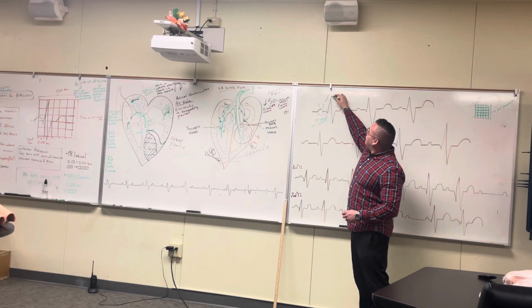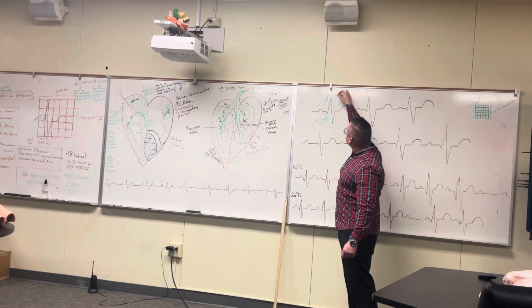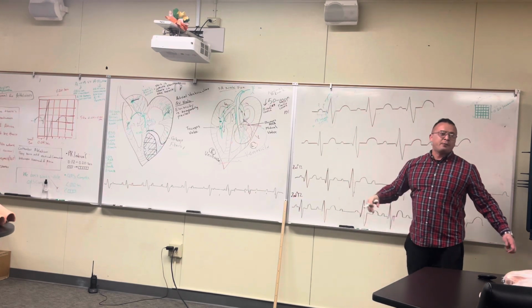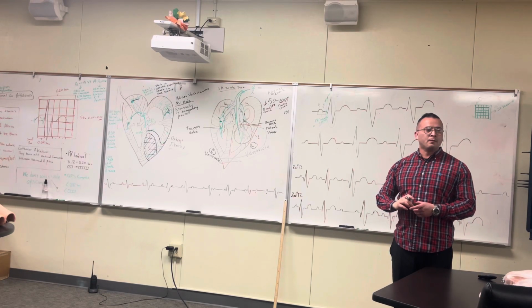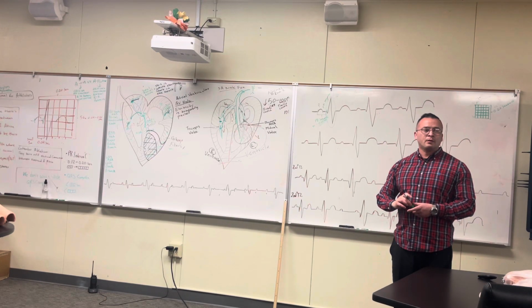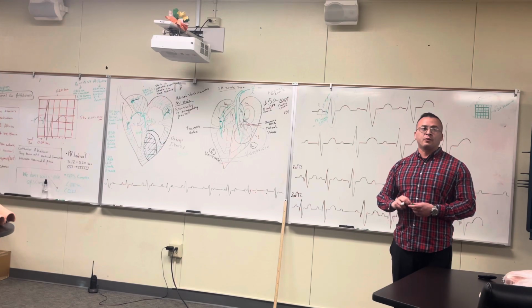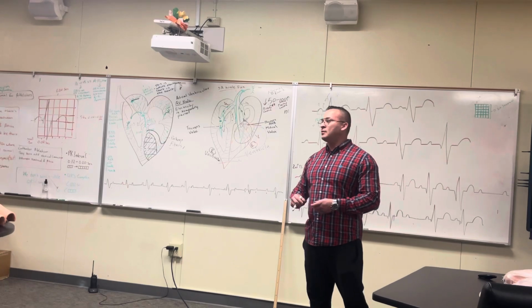And then what did I say this one right here was? QRS, cool. Alright, QRS. So right there with the P wave, what does the P wave represent? It represents two things. You can tell me one of them if you want, and then I'm gonna ask somebody else for the other one. Just give me one of them if you can find one. When you guys look it up, I'm gonna ask you.